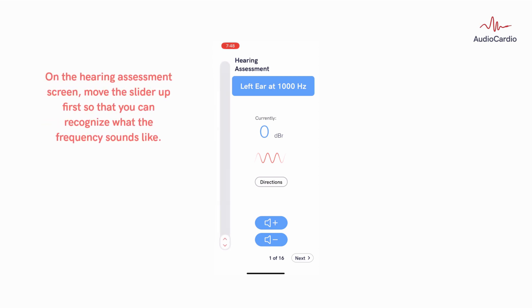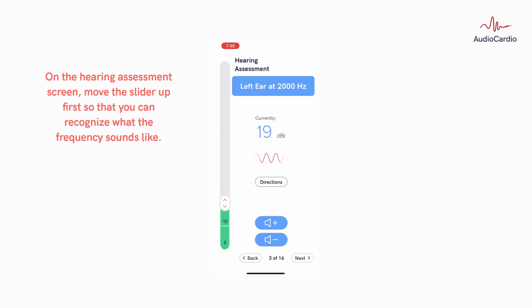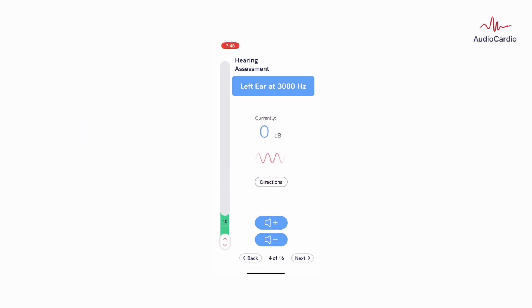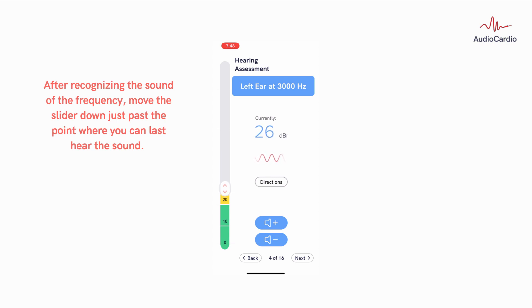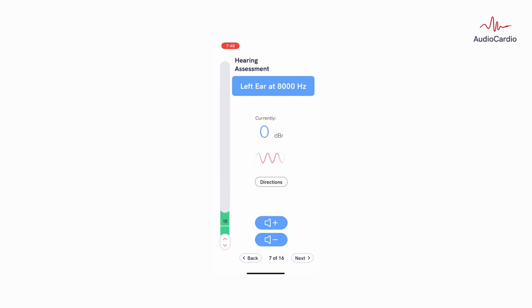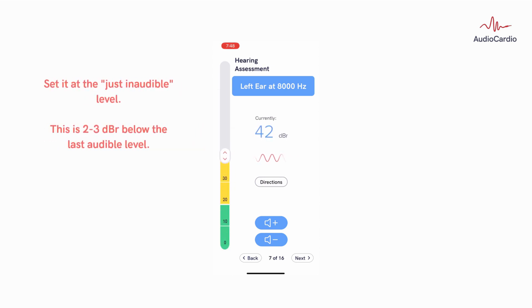On the hearing assessment screen, move the slider up first so that you can recognize what the frequency sounds like. After recognizing the sound of the frequency, move the slider down just past the point where you can last hear the sound. This is usually 2 to 3 dB below the last audible level.